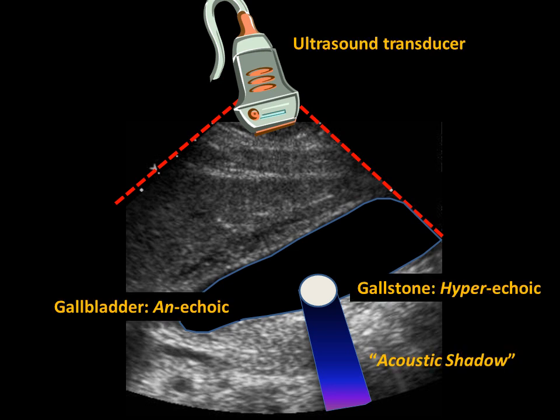Labeled on this image is the ultrasound transducer, the anechoic gallbladder, the hyperechoic gallstone, and the acoustic shadow.